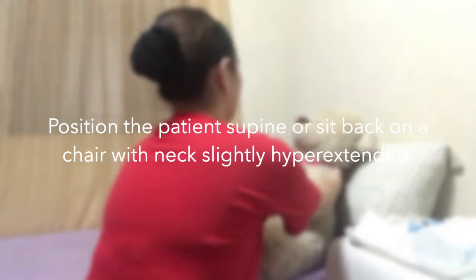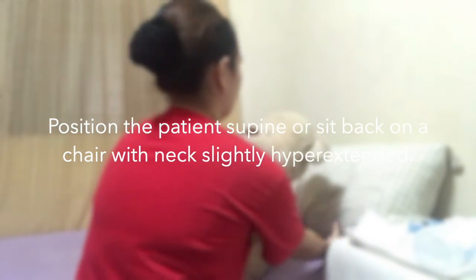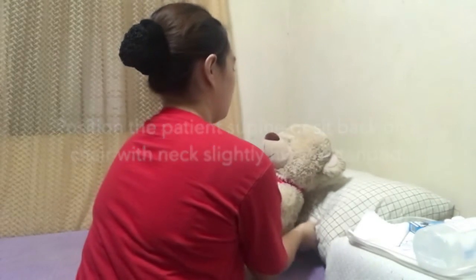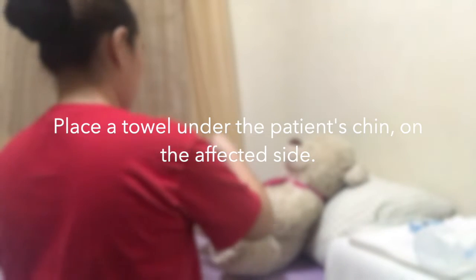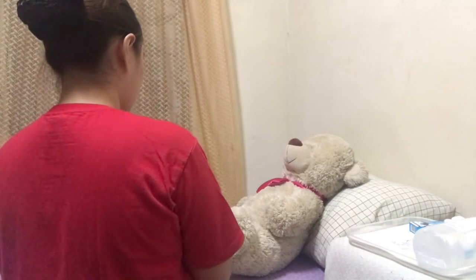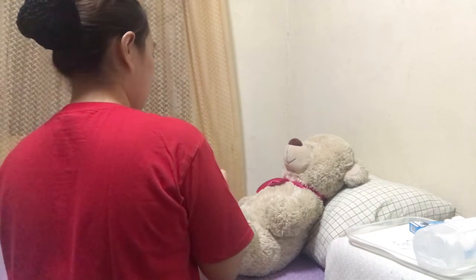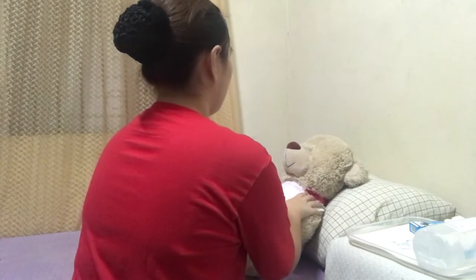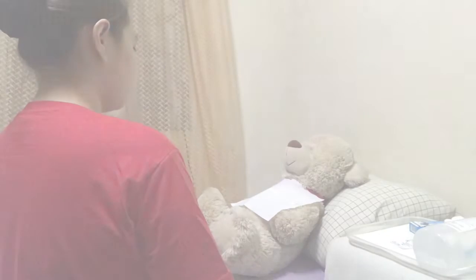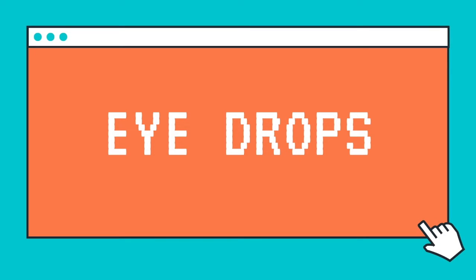Next, position the patient supine or sit back on a chair with neck slightly hyperextended. Then, place a towel under the patient's chin on the affected side. Placing the towel under the patient's chin on the affected side may prevent spillage as the towel draws moisture through direct contact. Now, let us proceed first to the eye drops.